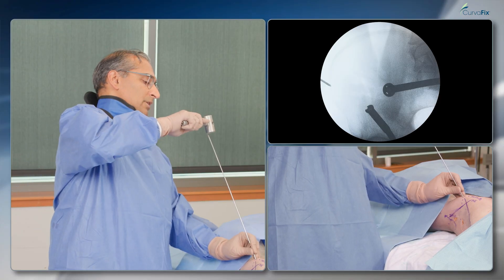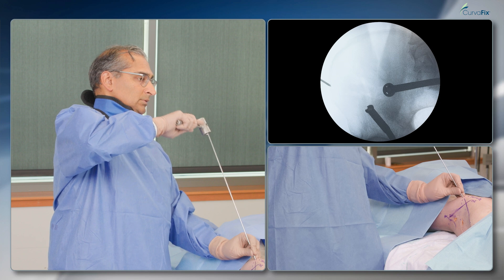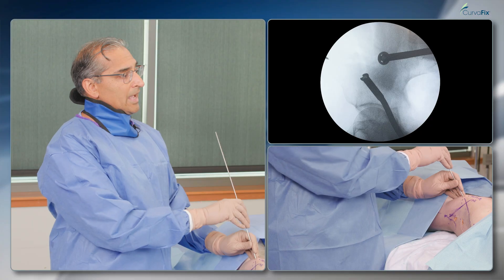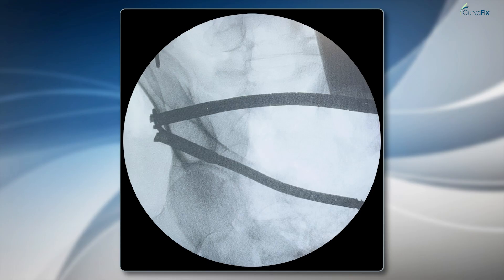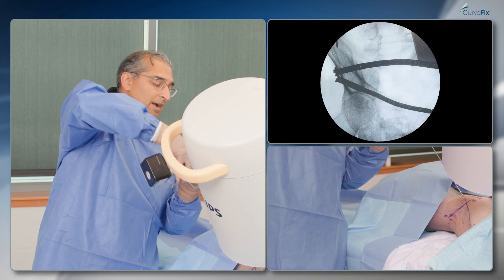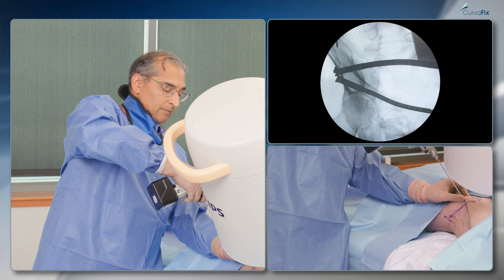I'll gently tap the wire in, maintaining my position between the columns. You can see I'm headed behind the acetabulum and not going too posterior, which would cause me to miss my posterior column. On the other view it looks like I'm bisecting the femoral head, which is the ideal position for the wire. You want to be aiming down towards the ischial tuberosity. I'll use the oscillate feature on the drill so I don't violate or breach the wing.